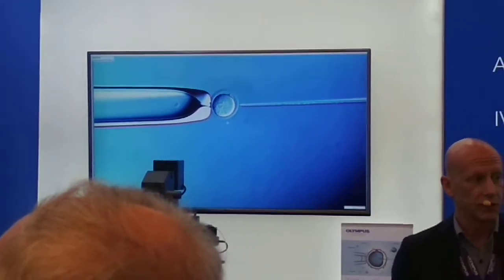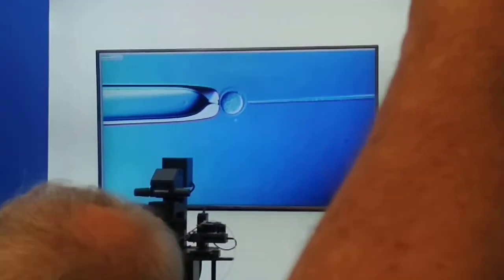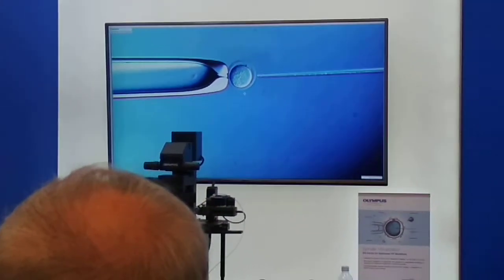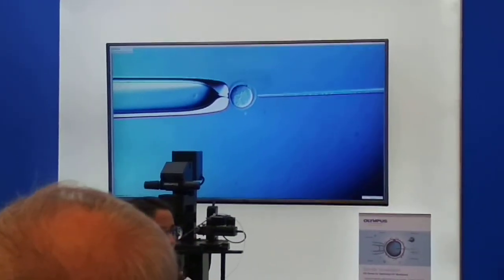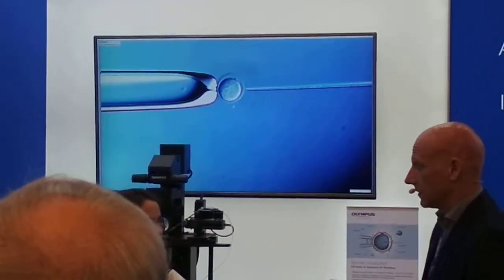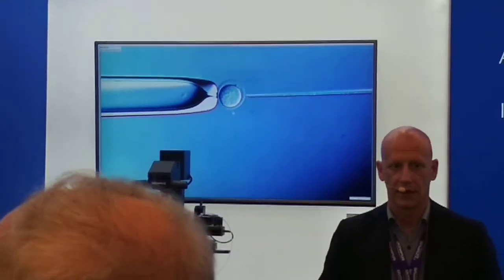See where the spindle is located, rotate the oocyte as Maria explained. So in these 2 axes, on the x-axis, rotate the oocyte until you have the spindle on your focal plane, and then rotate it clockwise or counterclockwise, depending on the location, so you can make sure that when you do the ICSI, you are not affecting the spindle.